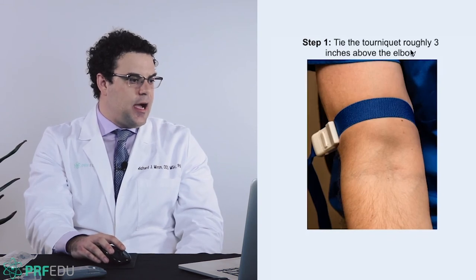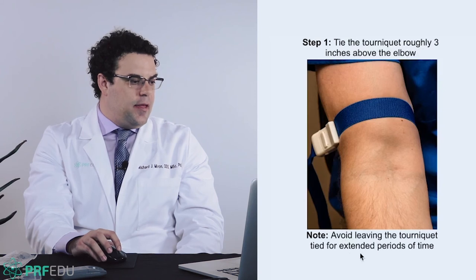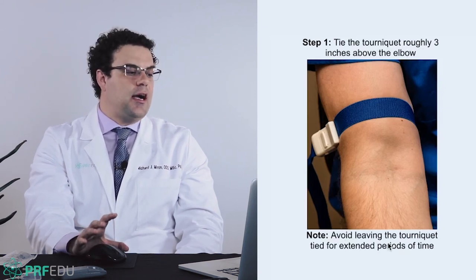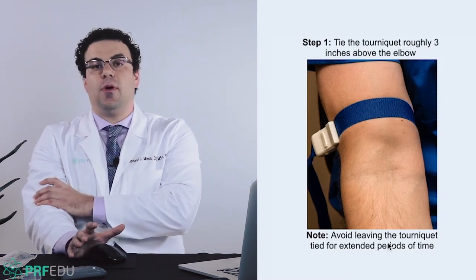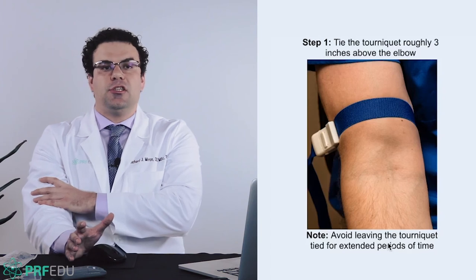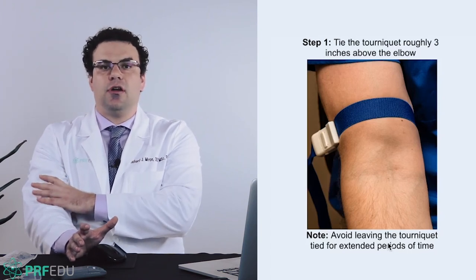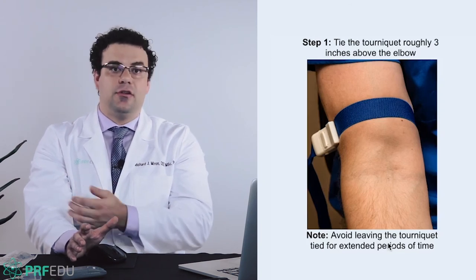Step one, tie the tourniquet roughly 3 inches above the elbow. And then there's some notes here, and I put these in the PDF file as well. Avoid leaving the tourniquet tied for extended periods of time, okay? When you actually tie the tourniquet, your body is going through, I don't want to call it suffocation mode, but you're blocking circulation. And if you leave the tourniquet on for too long, after a while, your body will adjust and then it'll start flowing again.